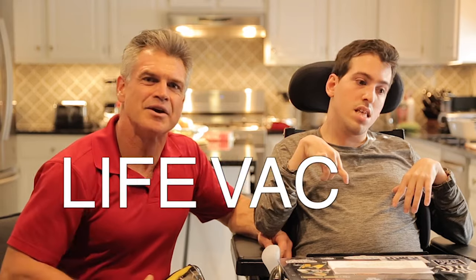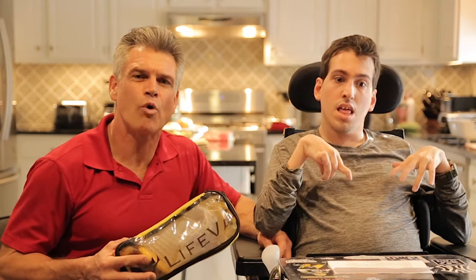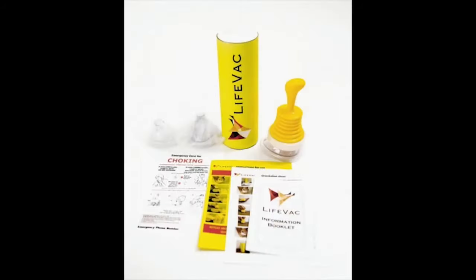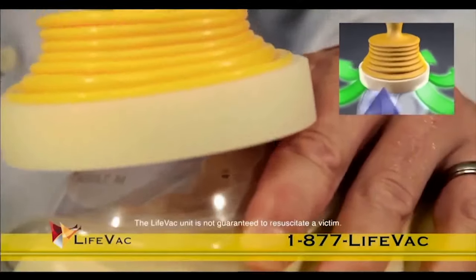That is why I carry an airway clearance device called the LifeVac. It is a non-invasive portable rescue option. It has peer-reviewed credentials on saving lives and most importantly, it is safe and easy to use. No medical expertise is necessary — it could be used by anyone.